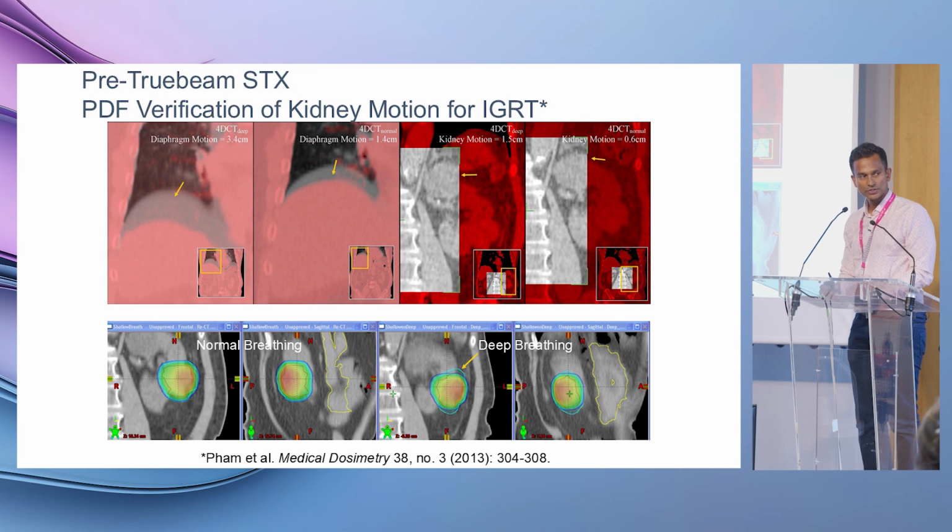Now, one thing that we did do is, because we recognize the limitations of a linear accelerator and cone beam CT, we also took an image at the liver diaphragm, the dome of the liver, because there is something that you can do, which is measure the gradient between the top of the liver dome and the bottom of the liver dome, which represents the breathing motion. This is something that you can use with a simple profile tool on a Varian Linac, just measuring that area from low density lung, middle density motion, and bottom density, which is all liver.